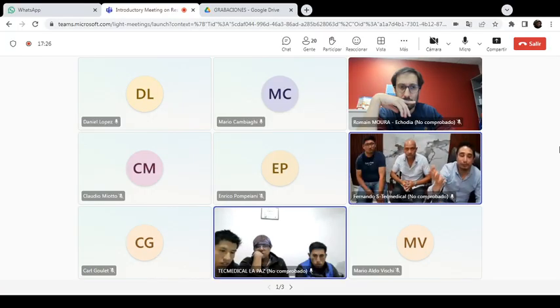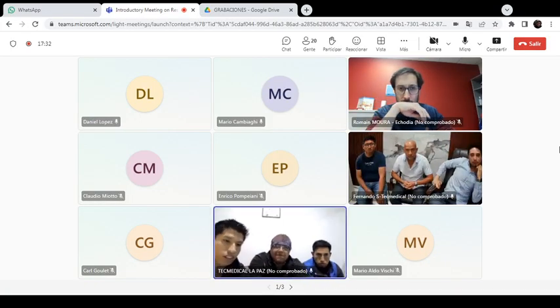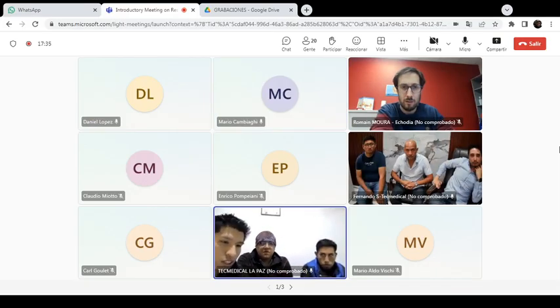We say, if all the studies that we do in Helios we can export them. That's the question of my colleague Fernando.